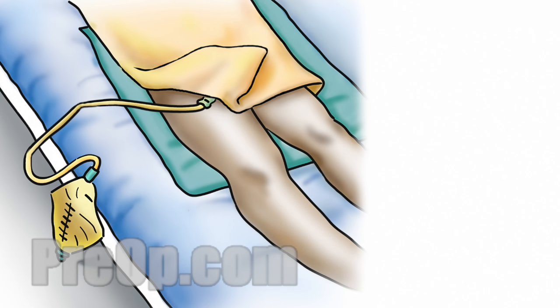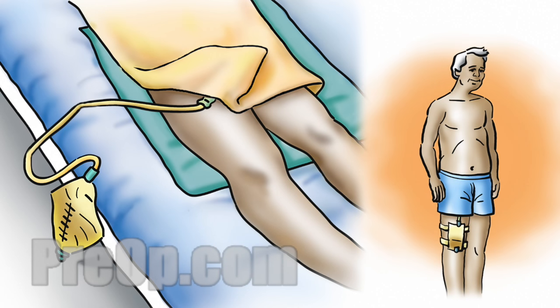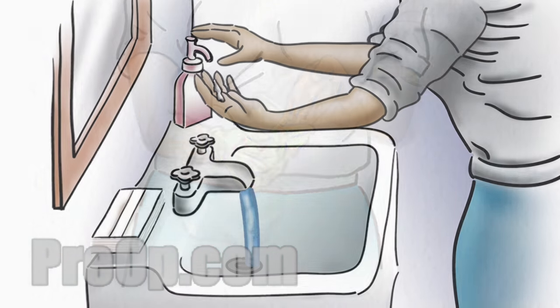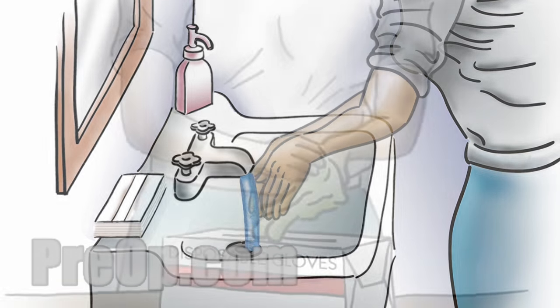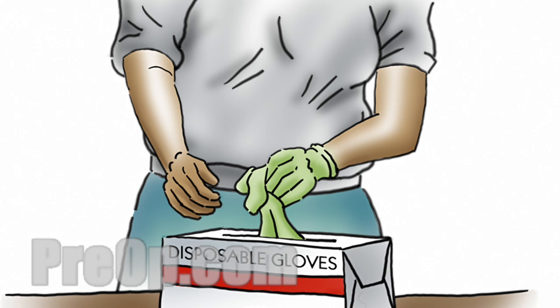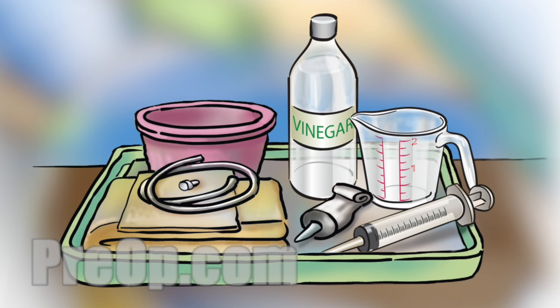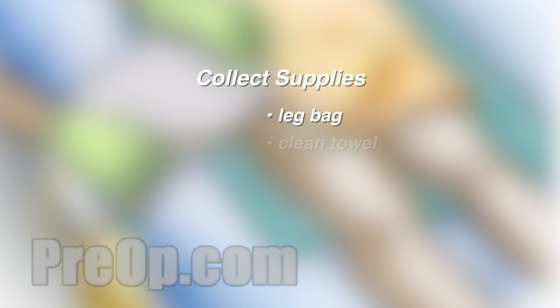Next, you may change the large overnight urine bag to a small leg bag to make it easier to move around during the day. Before changing the bag, take off your dirty gloves and wash your hands and put on fresh clean gloves. Put your supplies where they are easy to reach. You will need a clean or new leg bag, clean towel and alcohol wipes.